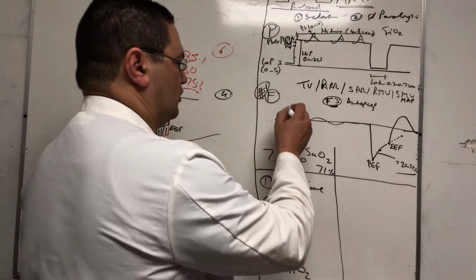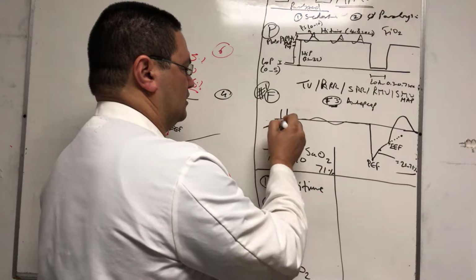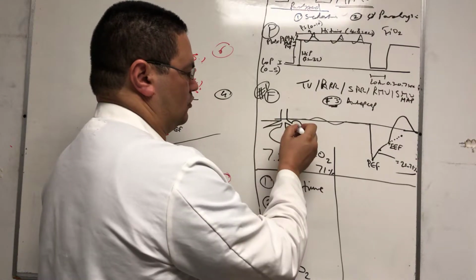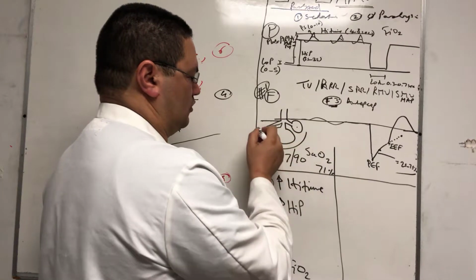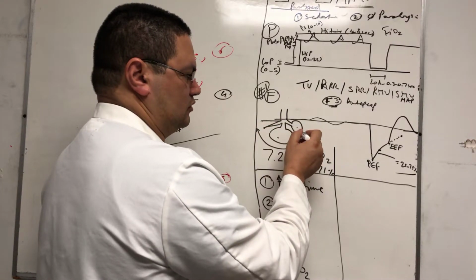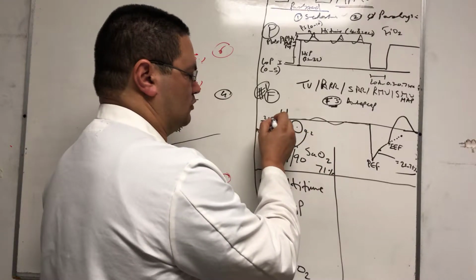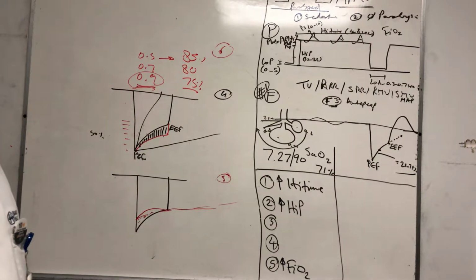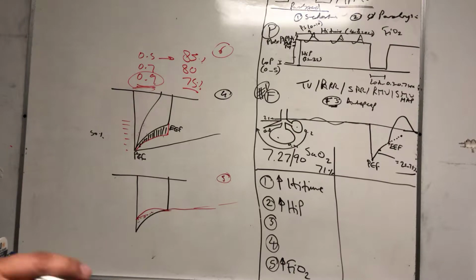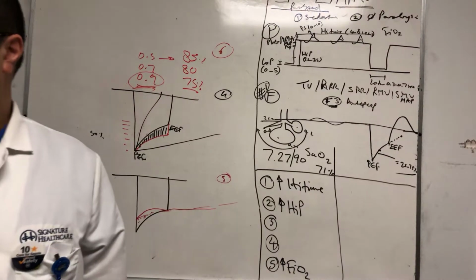It actually opens up all the alveoli that we drew yesterday. We drew multiple times the ARDS lung model: normal alveolus, hyperinflated, hypoinflated, and atelectatic. All of those were open. These were opened early, during 0.2 seconds, for example, 0.4 seconds, 0.8 seconds, 2 seconds or more. Once you go to 8 seconds and stuff like that, everything is going to open. So imagine a mode of ventilation that opens all your alveoli, even the closed ones, every release breath. All right, what else, Professor?